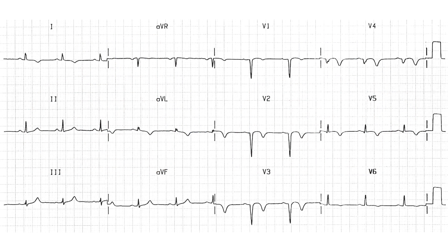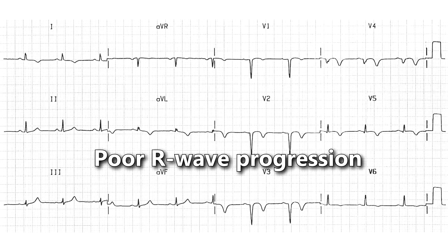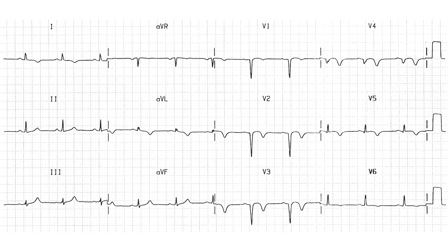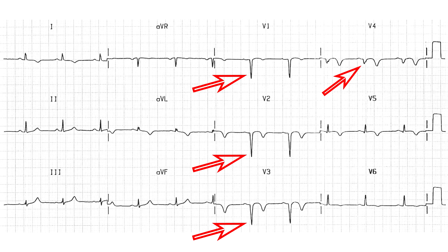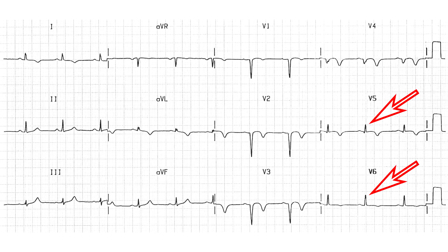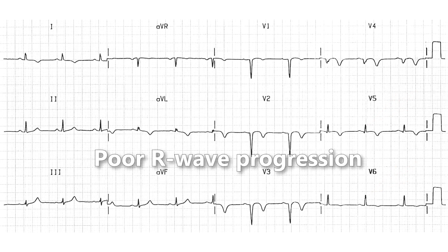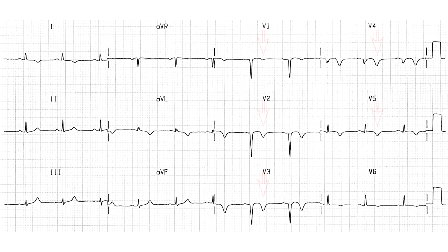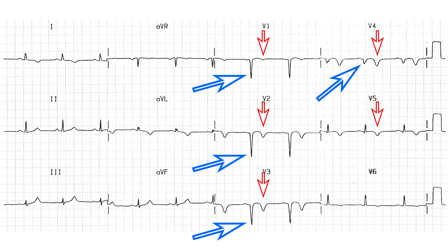If the height of R wave is not increasing gradually as we move from leads V1 to V6, it is called poor R wave progression. This is an ECG of a person who has a history of myocardial infarction. Focus on R wave as we move from leads V1 to V6 — from V1 to V4, only downward deflections of Q waves are present, and R waves are completely absent. R waves appear only in V5 and V6, so this ECG shows poor R wave progression. Also notice that T waves are inverted in the chest leads. These Q waves and inverted T waves are characteristic of people with a history of myocardial infarction.